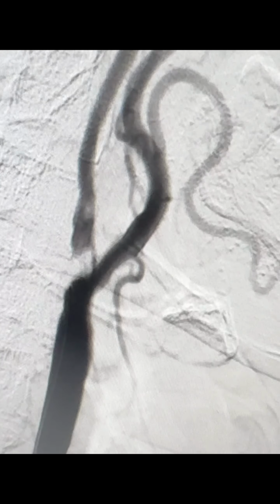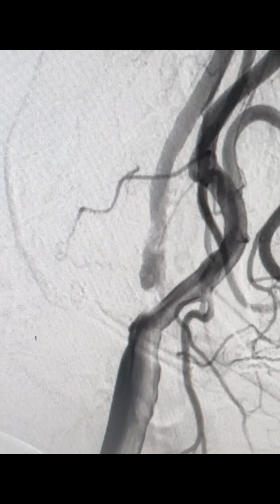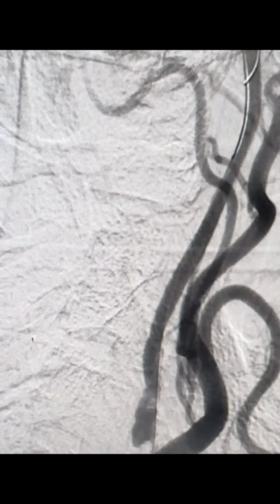In this DSA, we can see severely narrowed origin of the right ICA. So we planned for carotid angioplasty in this case. In this difficult tight stenosis of the right ICA, first we need to pass a microwire across the stenosed segment. With some effort, we were able to pass the microcatheter.